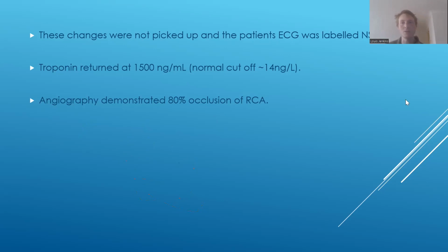Okay, but how could we know? I guess how could we know that this patient was having an inferior infarct?